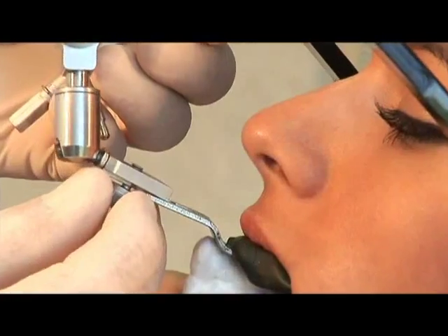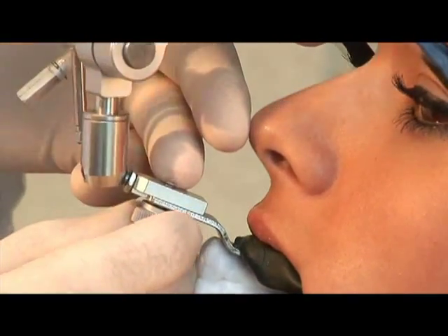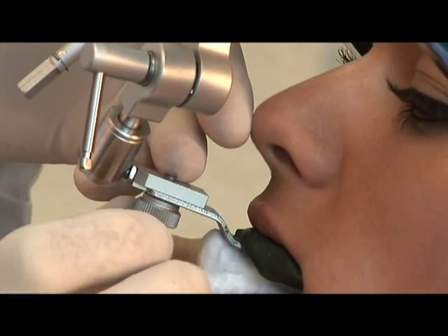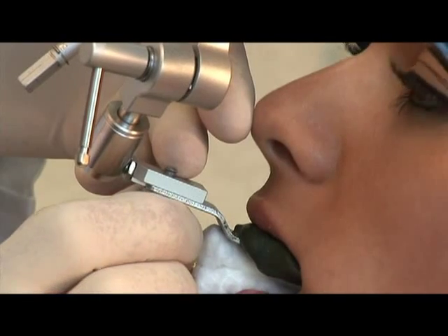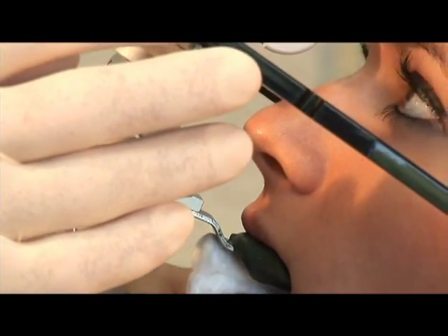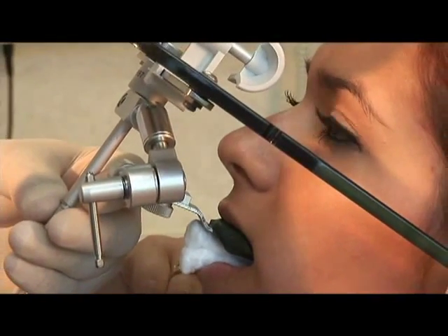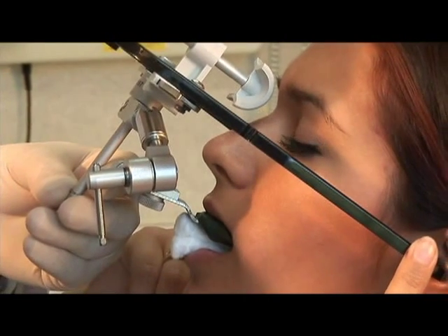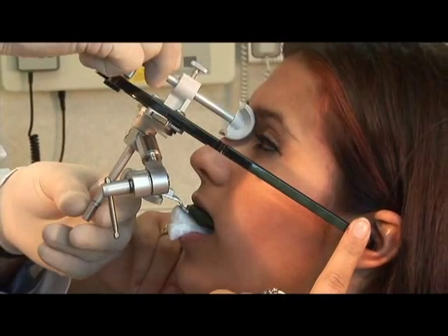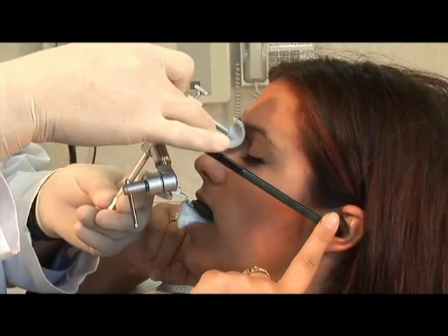Rotate this around right in place here. Make sure you're staying closed all the way on the cotton. Okay. Now this next piece is going to rest right against your nose. Actually, the bridge of your nose. You're going to feel a little pressure here. When you feel some pressure, I want you to push in lightly at your ears for me.